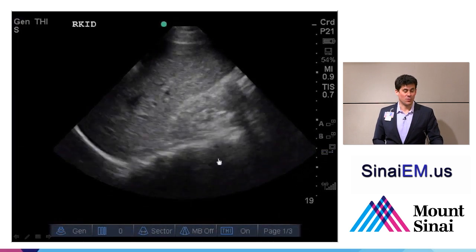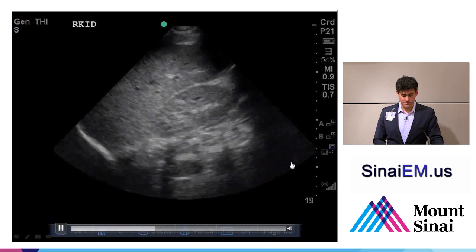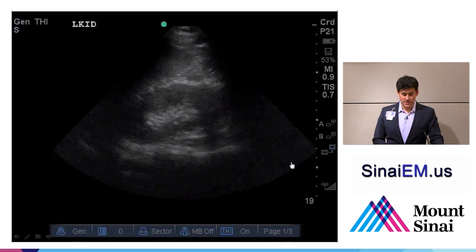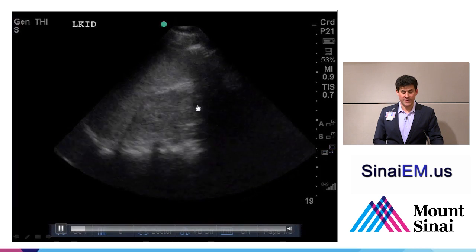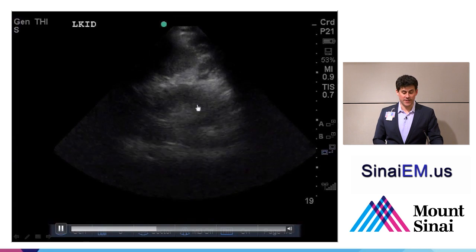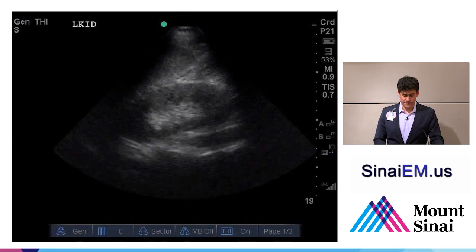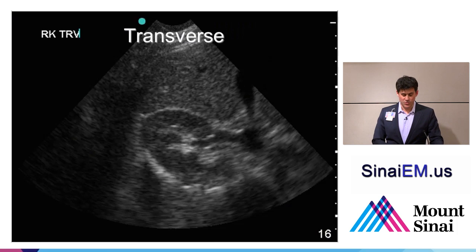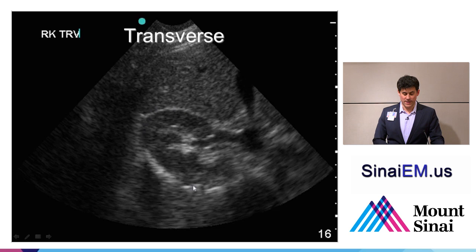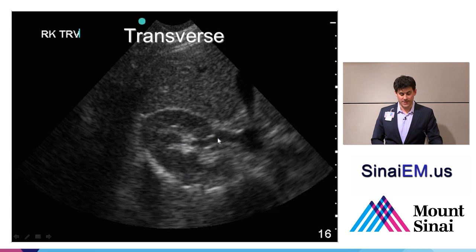We also don't want to miss fluid around the kidney. Similarly on the left side, the sonographer fans from posterior to anterior through the entire structure of the kidney. In the transverse view, the kidney looks more round or oblong and not as long as in the longitudinal view. We still see the outer cortex, inner medulla, and some of the collecting system as it exits through the hilum of the kidney.